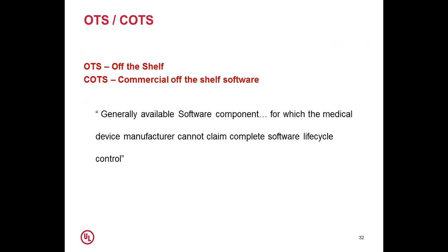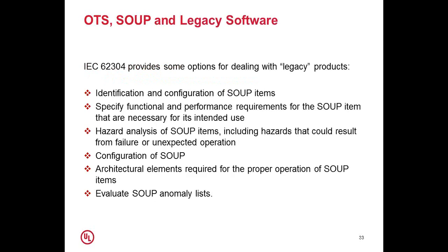So other terminologies which are used are off-the-shelf software, commercially off-the-shelf software, and these are generally available software components for which the medical device manufacturer cannot claim complete software lifecycle control. So if you look at IEC 62304, it provides some insights for dealing with the legacy or the SOUP or the OTS products.